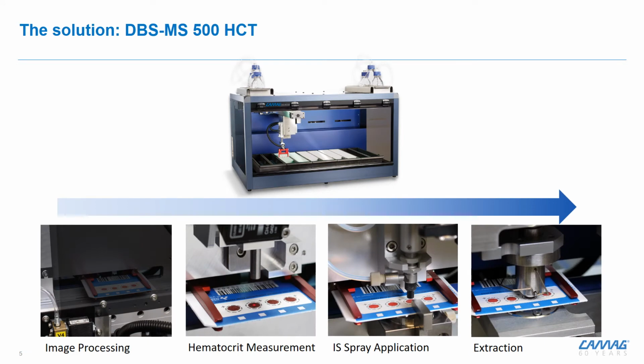So we have been working on creating automation for this field. And you can see this basically in the 4 modules displayed on this slide. First, we have image processing, where the card is analyzed in terms of the label and the spot quality. So we scan the spot location, the size, the area, and the roundness. Then followed by the hematocrit detection. This is a new module which we will launch in April this year. Then we spray the internal standard directly onto the blood spot before going to the extraction cell.